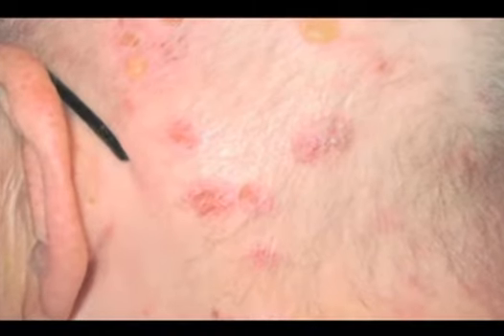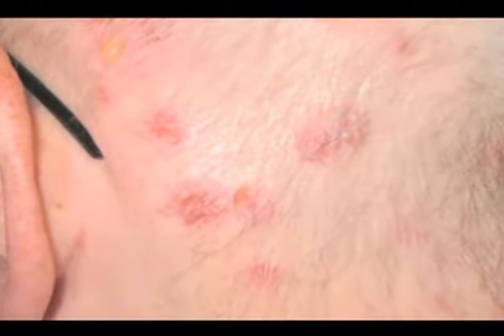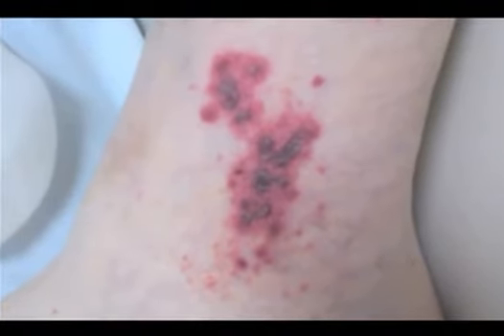Unless a specific lesion must be sampled, the biopsy site should be selected to obtain the maximal diagnostic yield and to minimize adverse aesthetic consequences. There are several other issues to consider when selecting a biopsy site. Fresh lesions without excoriation or secondary infection will provide the best diagnostic information.